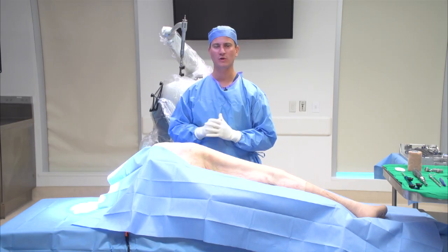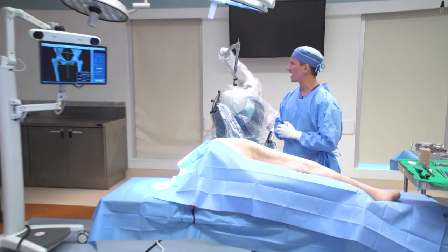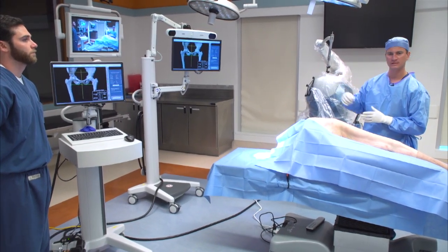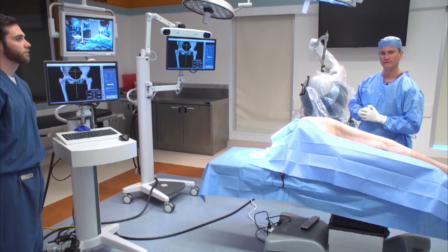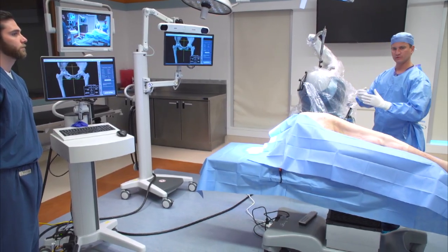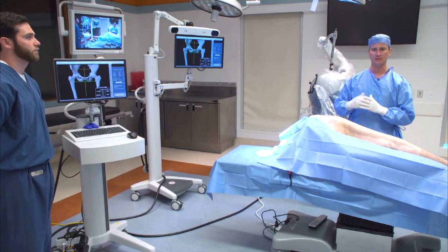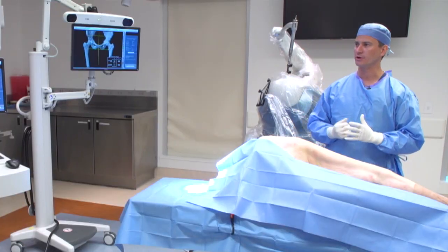There are a few pieces of equipment that I'd like to introduce. I'm going to start with the camera. So the camera is at the head of the bed, slightly off the corner, allowing the anesthesiologist access to the patient, and we still have excellent visualization of the screen. Then we have the Mako robotic arm that comes from the anterior aspect of the patient into the surgical field. And then lastly, we have our Mako product specialist who is not in the sterile field but operating our guidance cart. So now we're ready to get started.